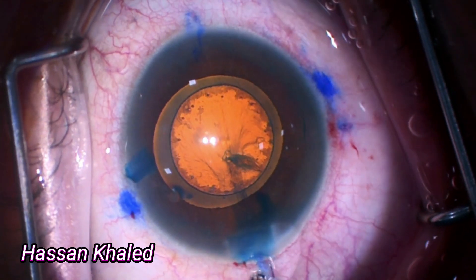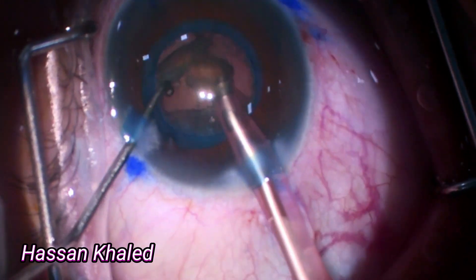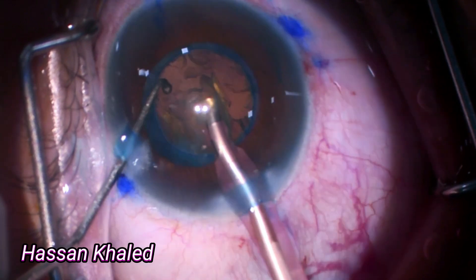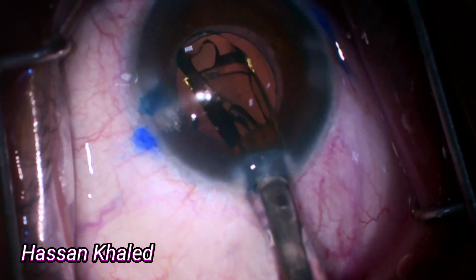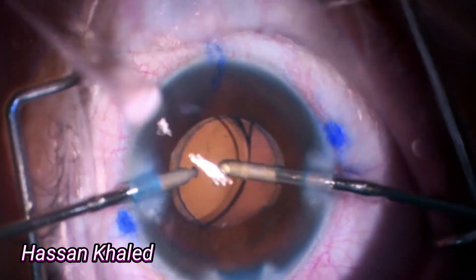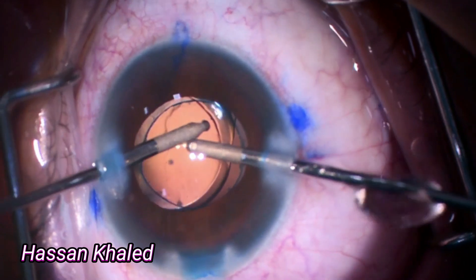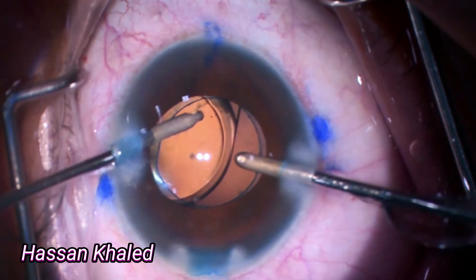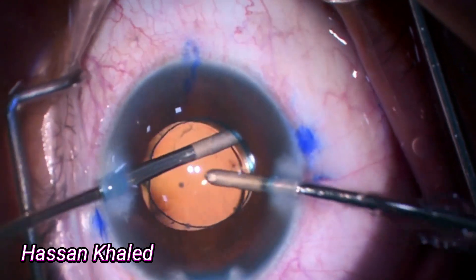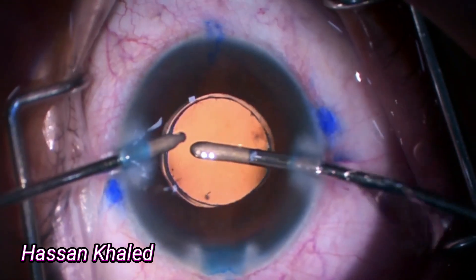Then removing the anterior capsule, followed by hydrodissection and phacoemulsification as usual for this case. Then bimanual irrigation and aspiration to remove the cortex. Now here is the toric IOL being implanted inside the capsular bag. Then washing out the viscoelastic behind the IOL once it is secure, and also anterior to the IOL.